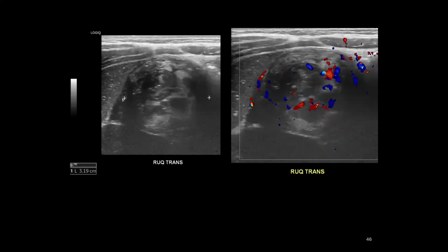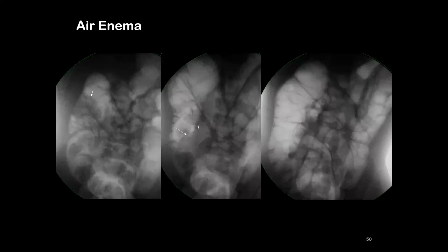And so there are a few other radiologic signs that we'll look for, like free air, to make sure that we can treat these in our department. But we can perform an air enema to do treatment for these. For the air enema, we take a rectal tube and put it into the bottom, and then we take what's effectively a sphygmomanometer, the little blood pressure-like pumper thing, and we inflate air, and we watch under fluoroscopy to see how the intussusception reduces.